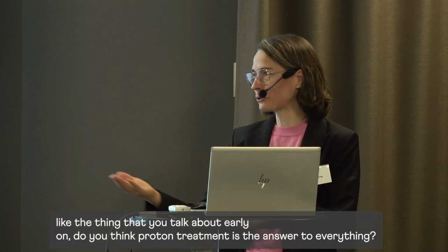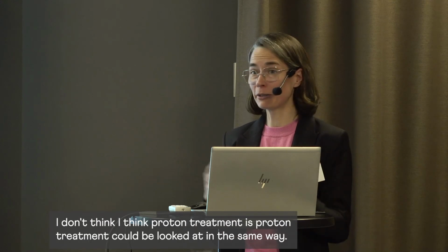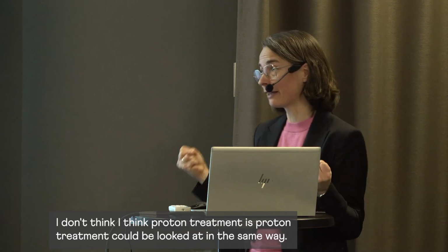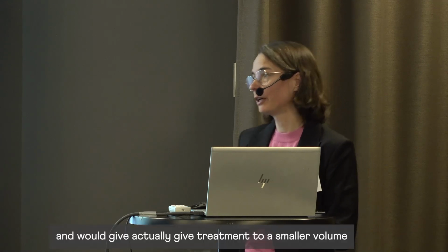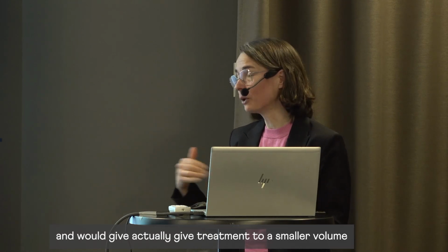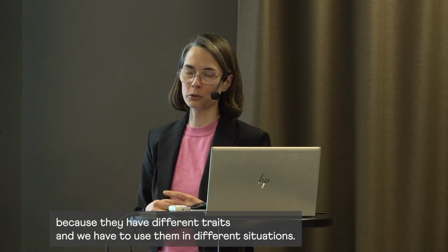Like the thing that you were talking about earlier on, do you think proton treatment is the answer to everything? I don't think so. Proton treatment and photon treatment could be looked at in the same way. We need to look at what volumes we're actually irradiating. Sometimes photon is superior to protons and would actually give treatment to a smaller volume, because they have different traits and we have to use them in different situations.